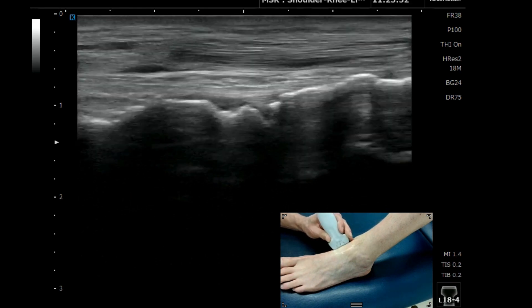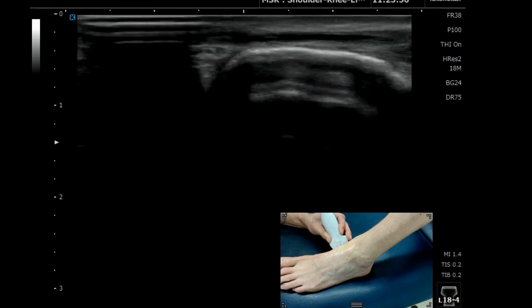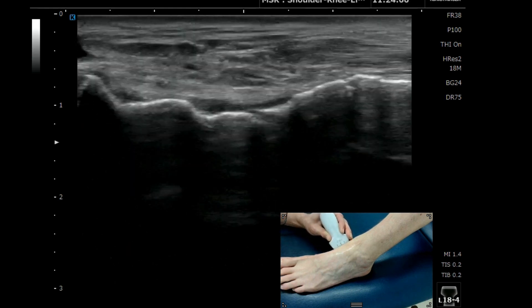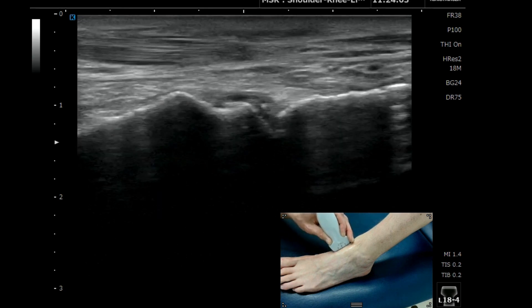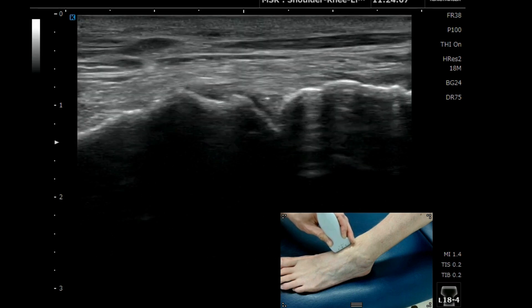You can roll the probe round and eventually we'll start to see that navicular tuberosity appear. You can then plot your way back round onto the dorsum to ensure that you're accurately on that joint.